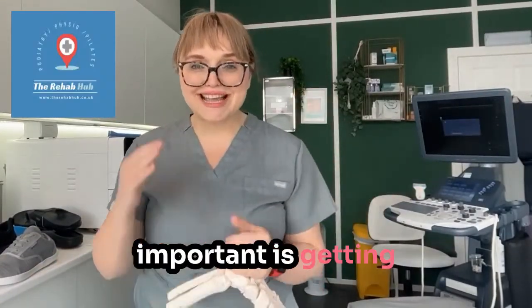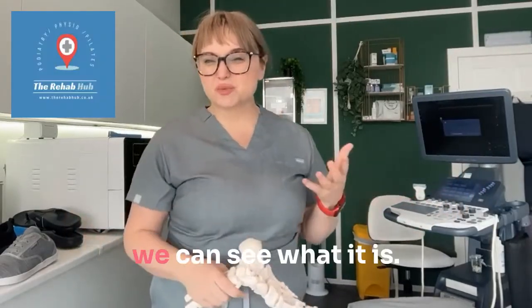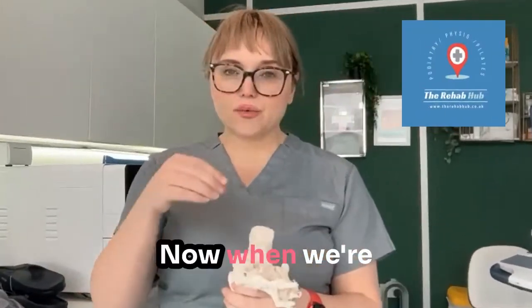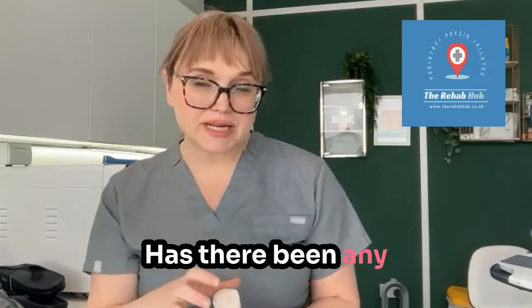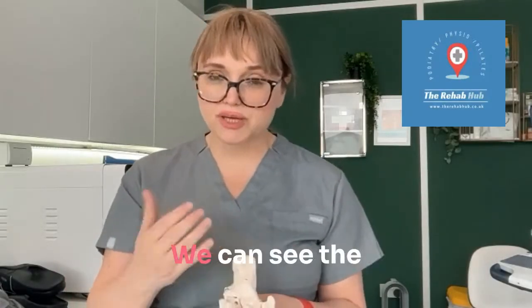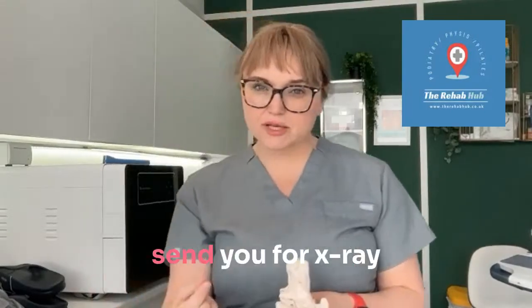First and most important is getting a proper diagnosis, and this is where the ultrasound comes into its own because we can see what it is. Now, when we're looking on ultrasound, we're looking at the cortex of the bone. Has there been any damage to the bone? Are there any breaks? We can see the cortex of the bone. If we did suspect a break, we would send you for x-ray.